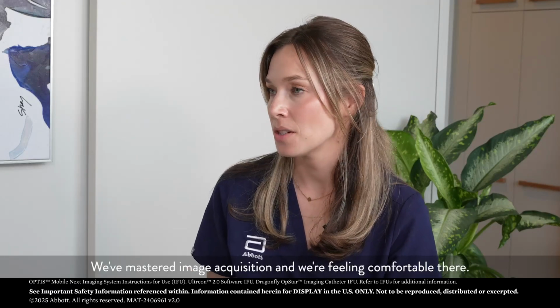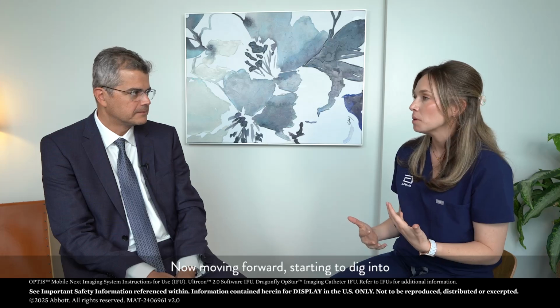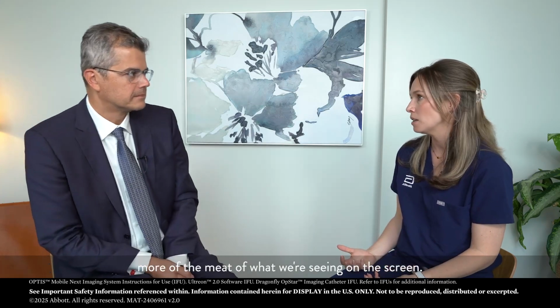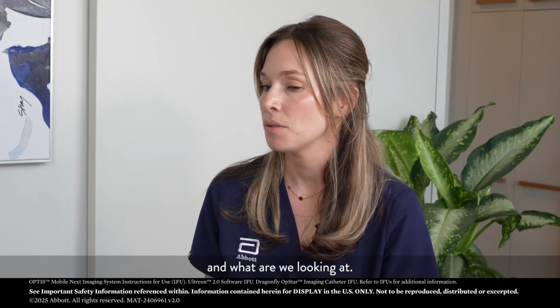So we have our image. It looks great. We've mastered image acquisition and we're feeling comfortable there. Now moving forward, starting to dig into more of the meat of what we're seeing on the screen. Talk to me about image interpretation and what are we looking at?